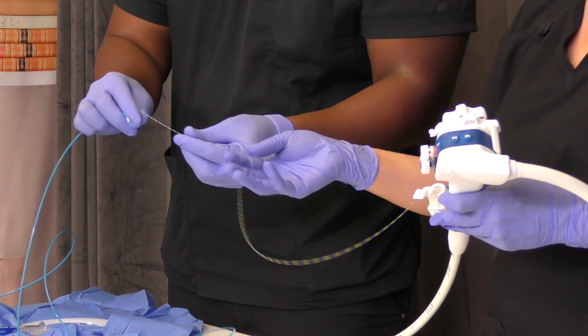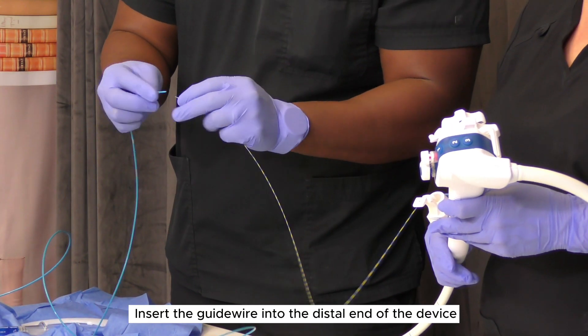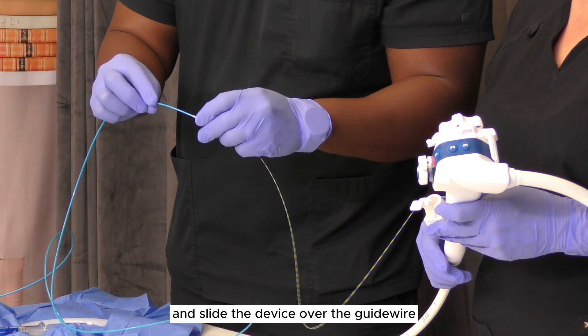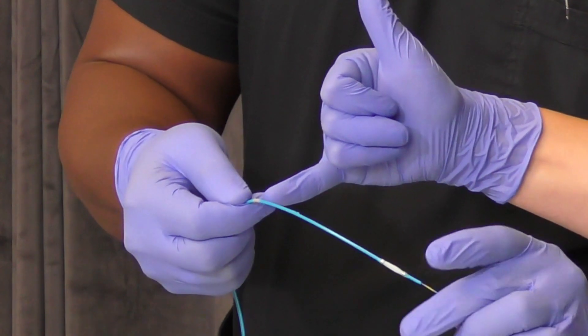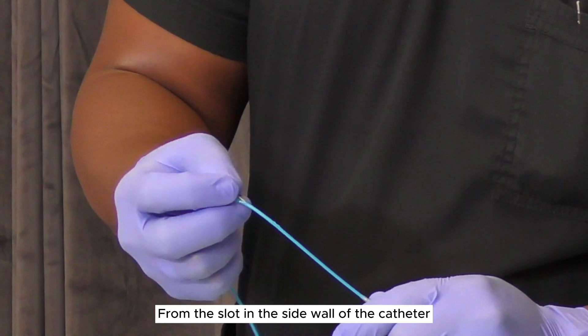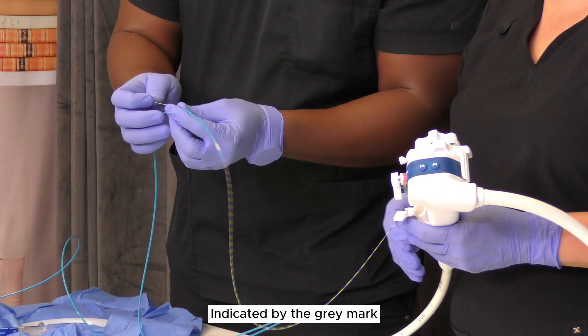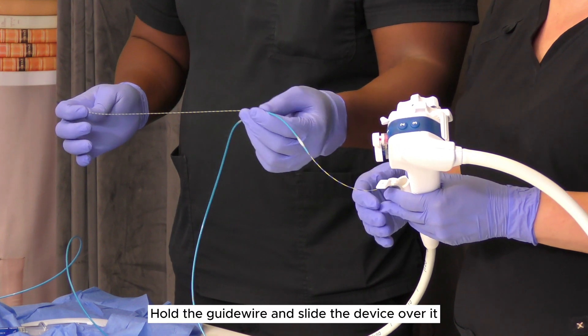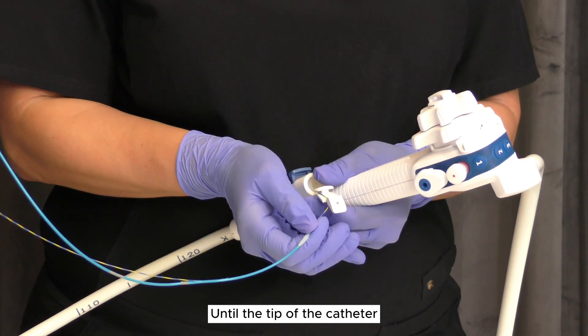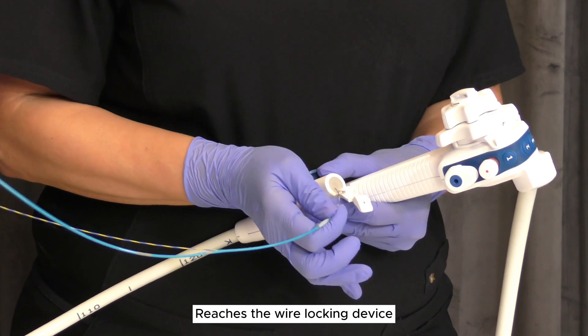Only insert the guide wire into the distal end of the device and slide the device over the guide wire. Separate the guide wire from the slot in the side wall of the catheter, indicated by the gray mark. Hold the guide wire and slide the device over it until the tip of the catheter reaches the wire locking device.